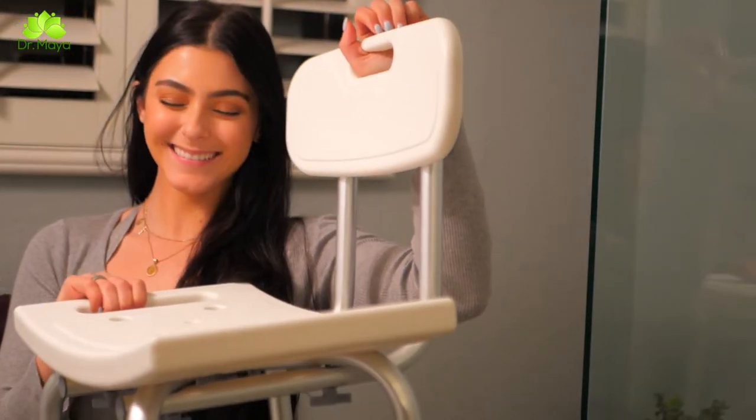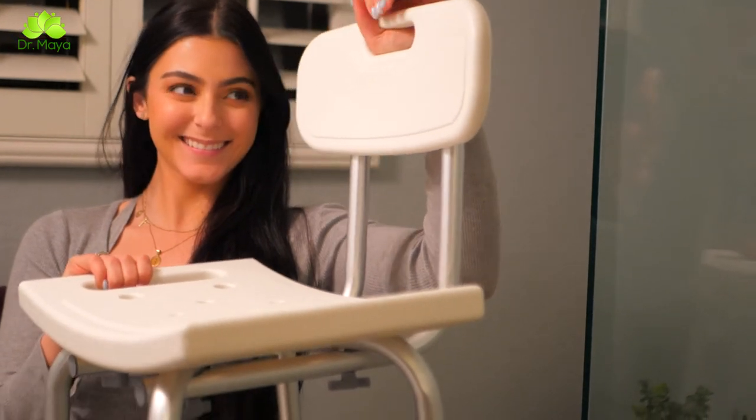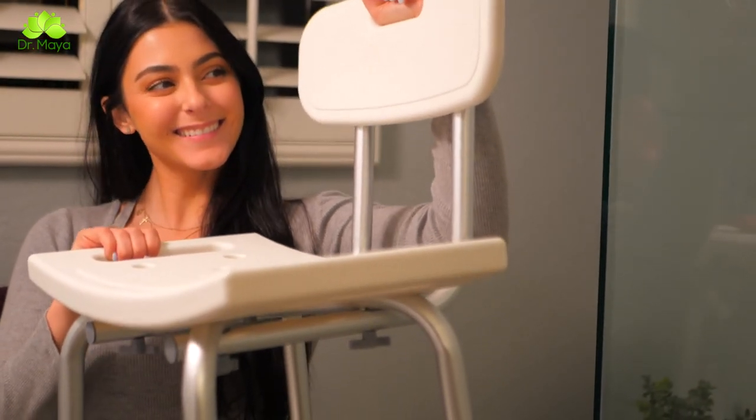When it comes to safety, go with the name you can trust — Dr. Maya shower and bath chair with backrest.